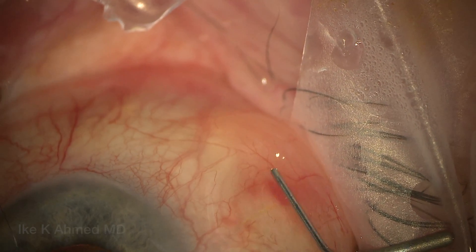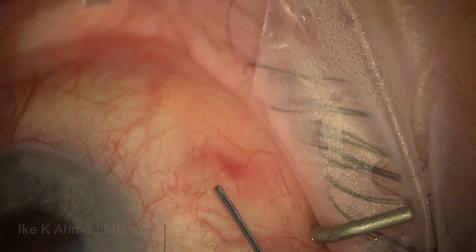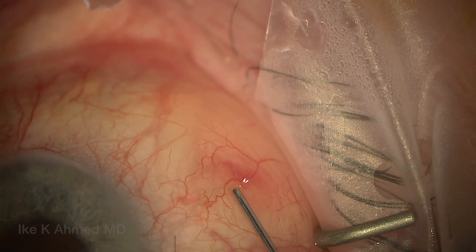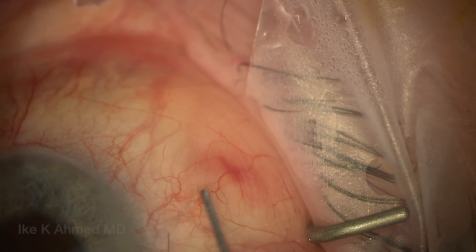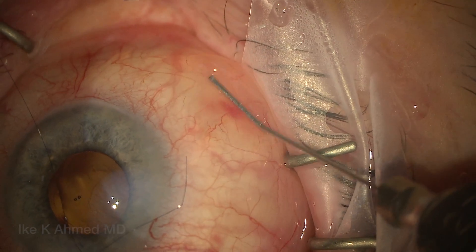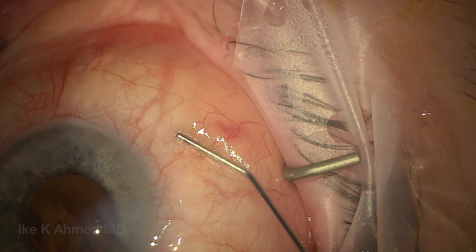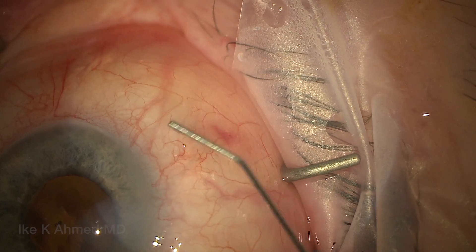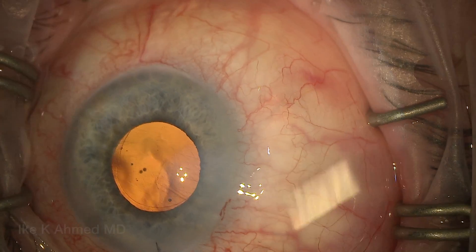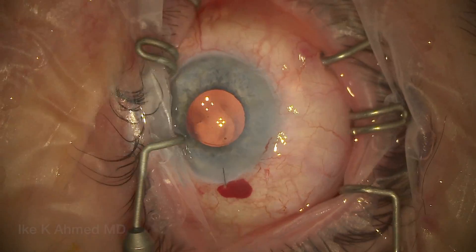The implant is actually sitting up, rising above the sclera — this is the ideal position of the implant, telling us that we're superficial in placement. It's not deep because the implant is sitting above tenons and actually under conjunctiva. It's not a problem to have it point up a little bit like that — I think it's ideal in fact. You can see how wide the extension of that fluid goes, telling us we have a more subconjunctival rather than a subtenons or intertenons placement. Looking at the conjunctiva, you can see how translucent it is — you can see tenons and sclera underneath, confirming that we've separated conjunctiva from tenons with this very thin, elevated bleb. The intraocular pressure is quite good, typically because of the controlled flow, and we have a well-formed wide bleb at the end of the case, which is ideal in these scenarios.